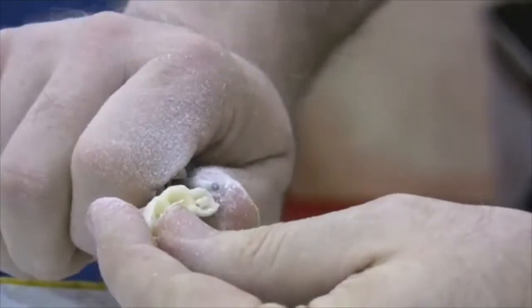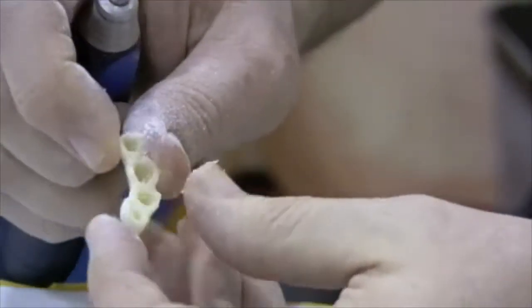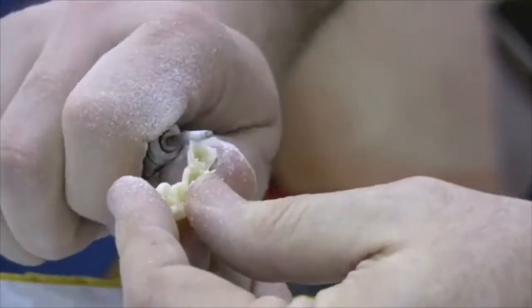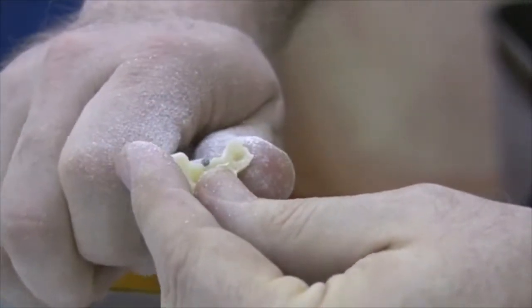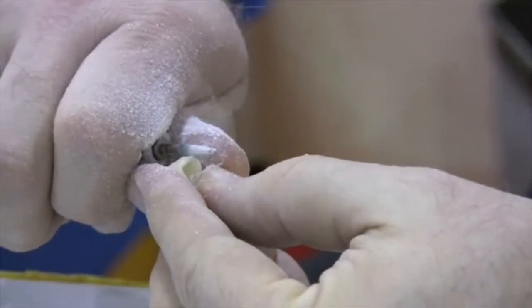As far as the carving, you'll notice a little bit of difference in the chemistry from Tough Temp. This is not a bisacryl, so you can see how it powders like acrylic when carving it. The uniqueness of this chemistry is that you'll be able to bend a little bit before it breaks.